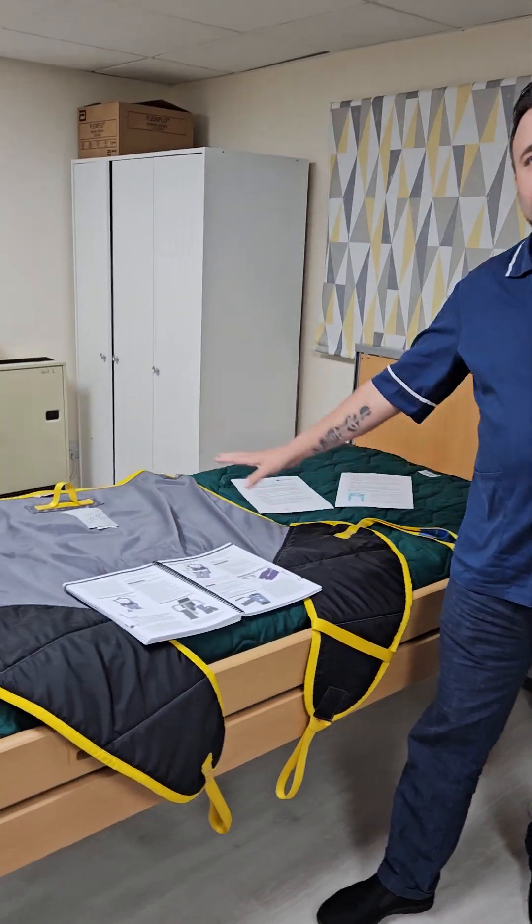Welcome to this video on how to use slings. Before we start using slings in people's homes there are a few health and safety checks that you need to make sure you're doing, as well as understanding the risk assessments, and we'll talk about that in another video. But for this video let's just talk about the sling.